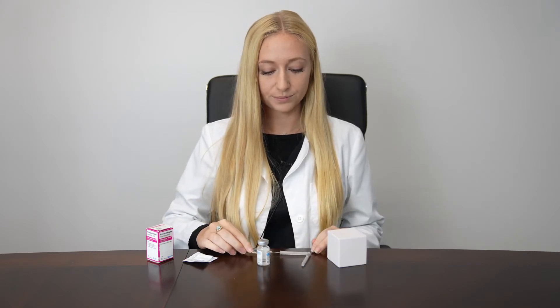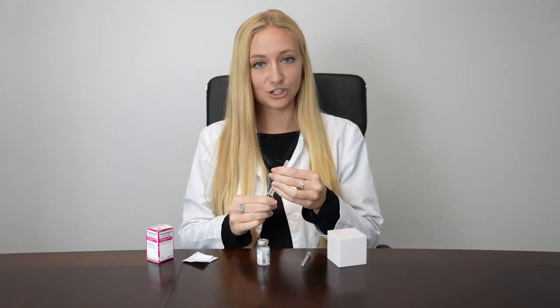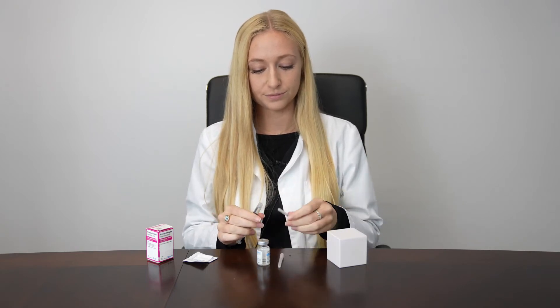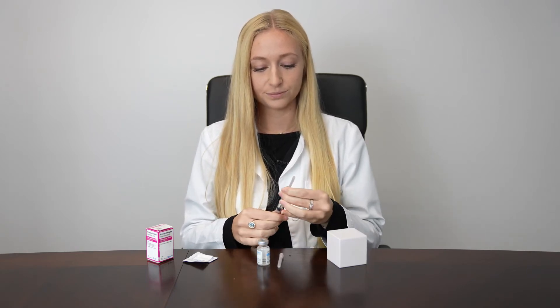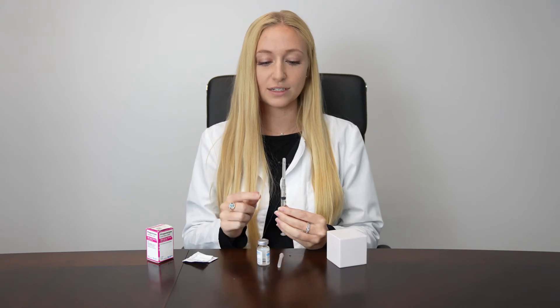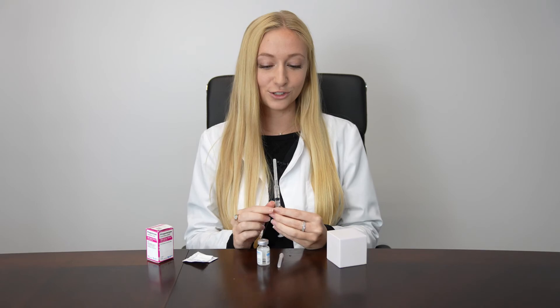Carefully cap your needle and exchange it for your injection needle. With your syringe facing upward, gently tap the side to expel any air bubbles. Push up on the bottom of the plunger until you see a bubble of liquid at the top — that's how you know you don't have any more air in your syringe.